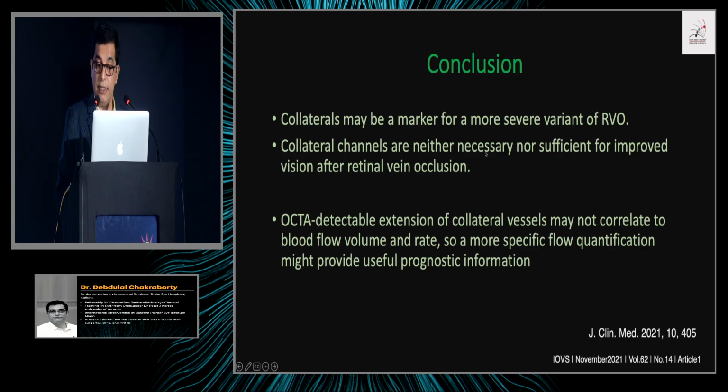Collateral channels are neither necessary nor sufficient for improved vision after retinal vein occlusion, and OCTA-detectable extension of collateral vessels may not correlate to blood flow volume and rate, so a more specific flow quantification might provide useful prognostic information.